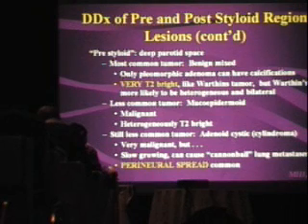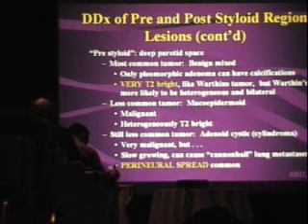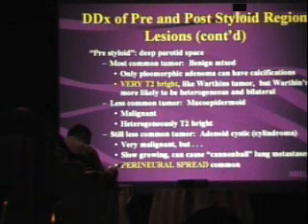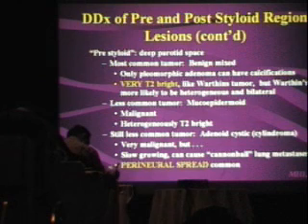Most tumors, and what is the mnemonic for those malignant tumors? It's the same as for bronchial lesions. You know the CAMP, the CAMP mnemonic? Cylindroma, adenoid cystic, mucoepidermoid, or pleomorphic. It's the same as for bronchial adenomas. It's the mnemonic for epithelial lesions, epithelial tumors. Okay, so those can still be T2 bright, but those enhance very homogeneously and immediately, very rapidly.